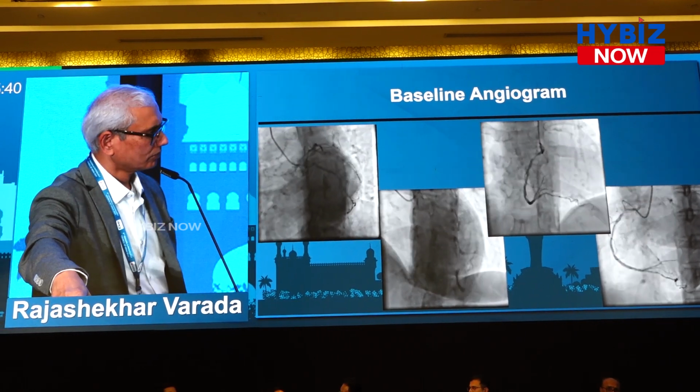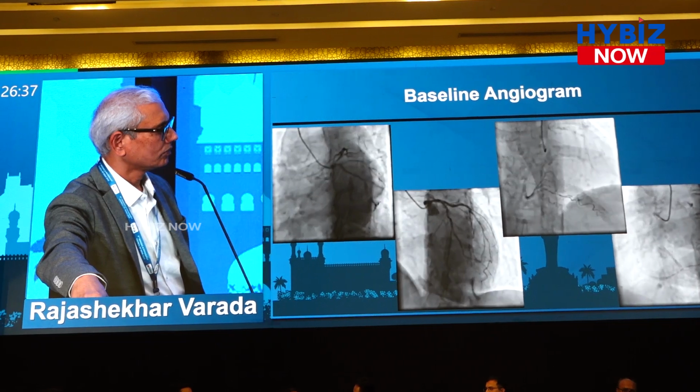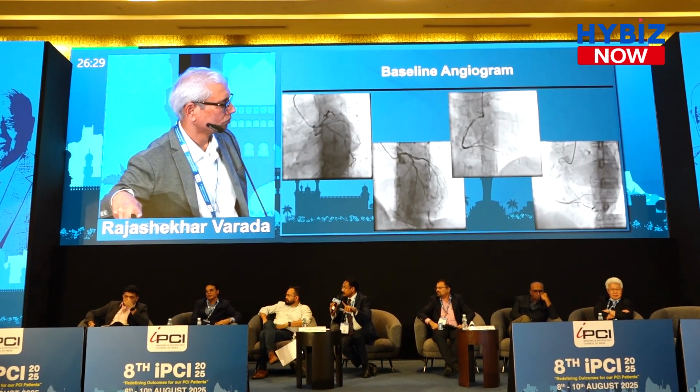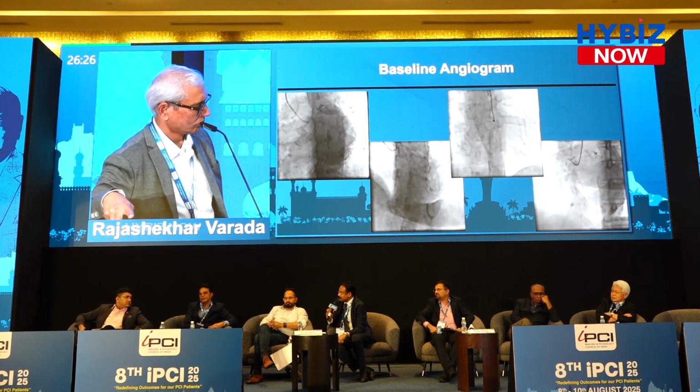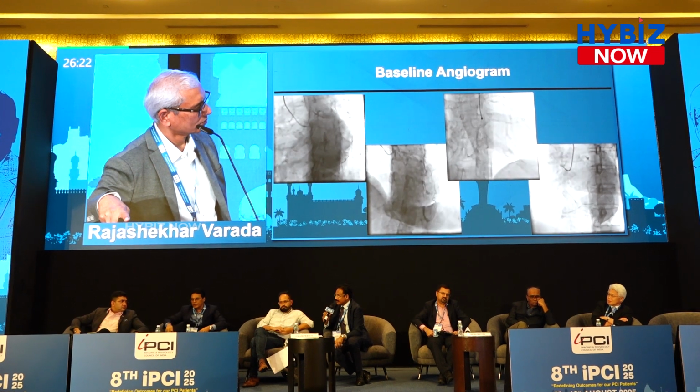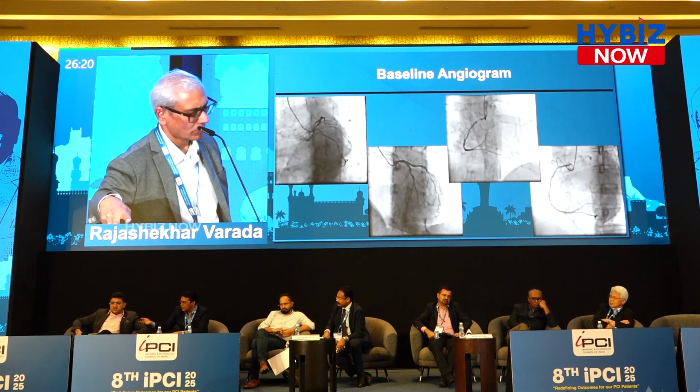That's why I think we should have a separate run from the circumflex of the imaging catheter. We have to look at the circumflex ostium. Is there calcium sitting exactly diametrically opposite to the circumflex ostium? That can create problems for the circumflex ostium. Otherwise, we can go with smooth sailing with a crossover stent.